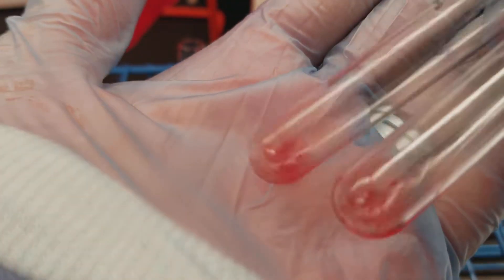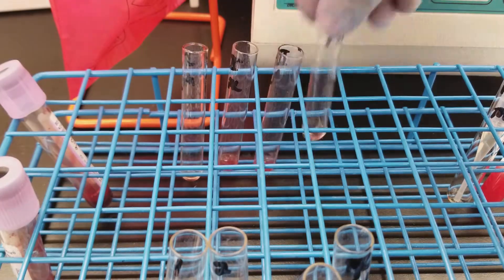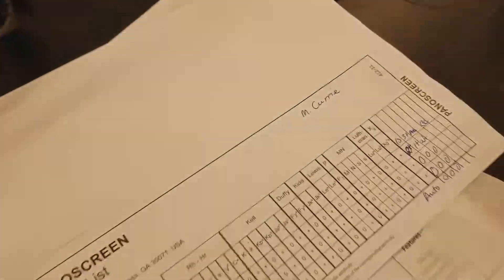Now for the other set: we've got 2+ in both of those. Here's the auto — that's more like a 1+. We did not add anything to the already-positive tube, so we're not recording that. For the other patient's results, we said 1+, 2+, and 2+.